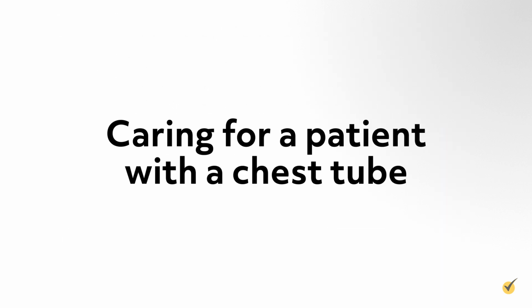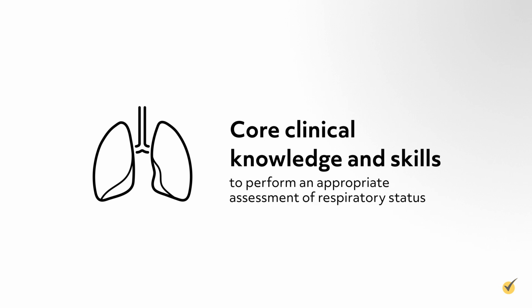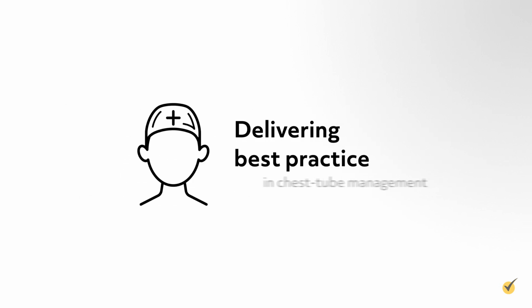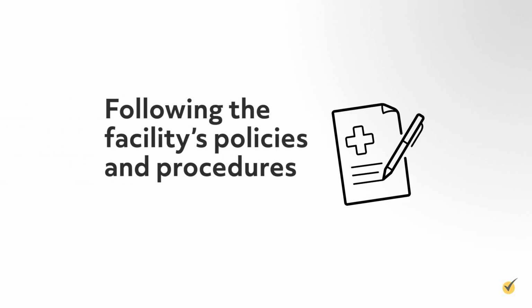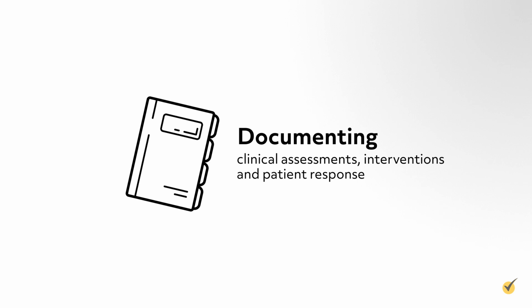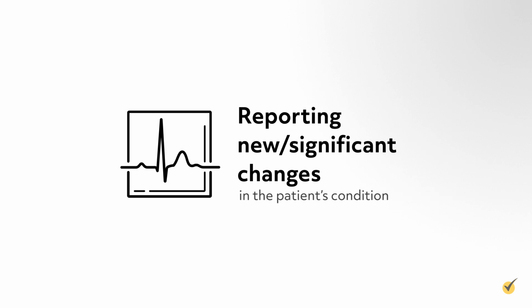When caring for a patient with a chest tube, the nurse is responsible for the following: having core clinical knowledge and skills to perform an appropriate assessment of a patient's respiratory status, identifying assessment findings outside the normal range, and delivering best practice in chest tube management, following the facility's policies and procedures and CDU manufacturer's recommendations when providing care and documenting clinical assessments, interventions, and patient response, practicing hand hygiene and maintaining aseptic technique when handling equipment, and reporting new or significant changes in the patient's condition.